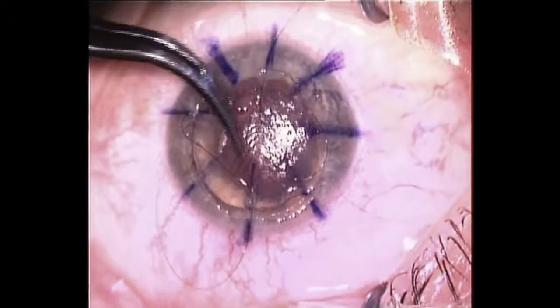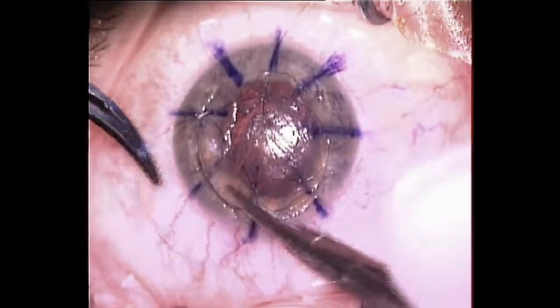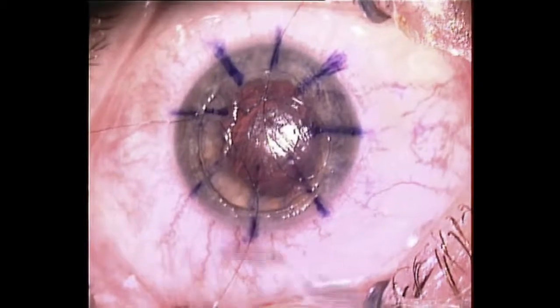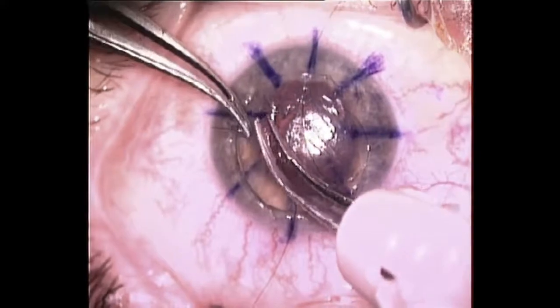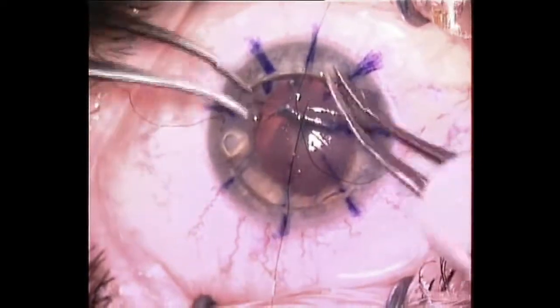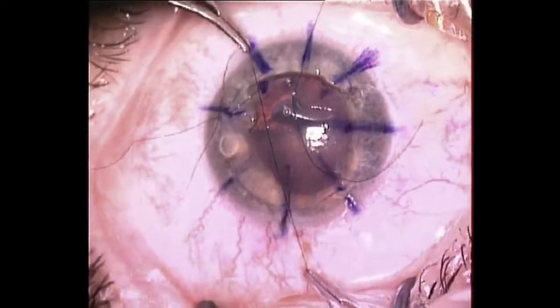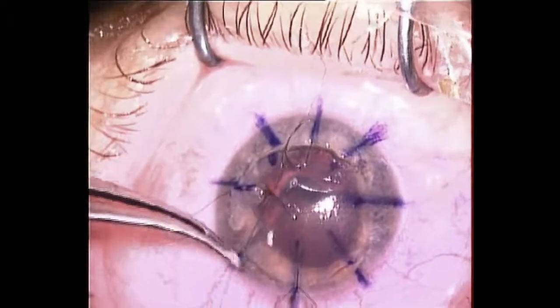Ten-O nylon is used for the purpose. Symmetrical stitches in the same meridian are used every time in order to create symmetrical traction on the flap and symmetrical attachment of the flap to the corneal stroma. The area with melting and the hole that has happened in the flap will be left alone, as far as there is no way to cover this disruption, and indeed this will be distorted by the stitches, but there is no other way to close this epithelial ingrowth. If you don't use the stitches, there is 100% probability of epithelial re-ingrowth, as it always happens in these severe cases.